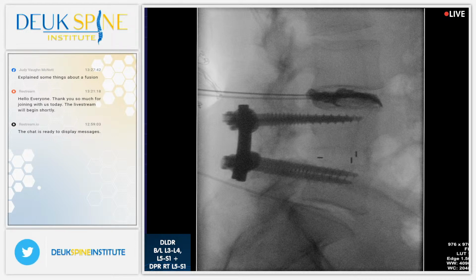Folks, take a look at that x-ray. Jordan, show us. Henry, go to the x-ray. Okay, you see this black dye that we injected that used to not be there? Look at the size of the tear in the back of the L3-4 disc. It's massive. The black dye fills the tear. There should be zero tear, should be zero dye there. That's where his pain's coming from. He's got a huge herniation. So we're going to clean that tear up, get rid of the herniation. That will take his back pain away.